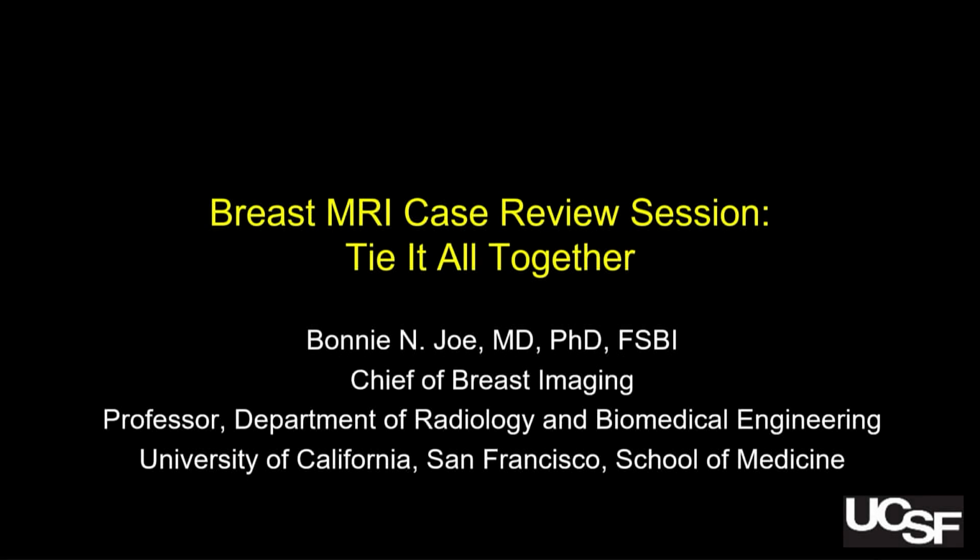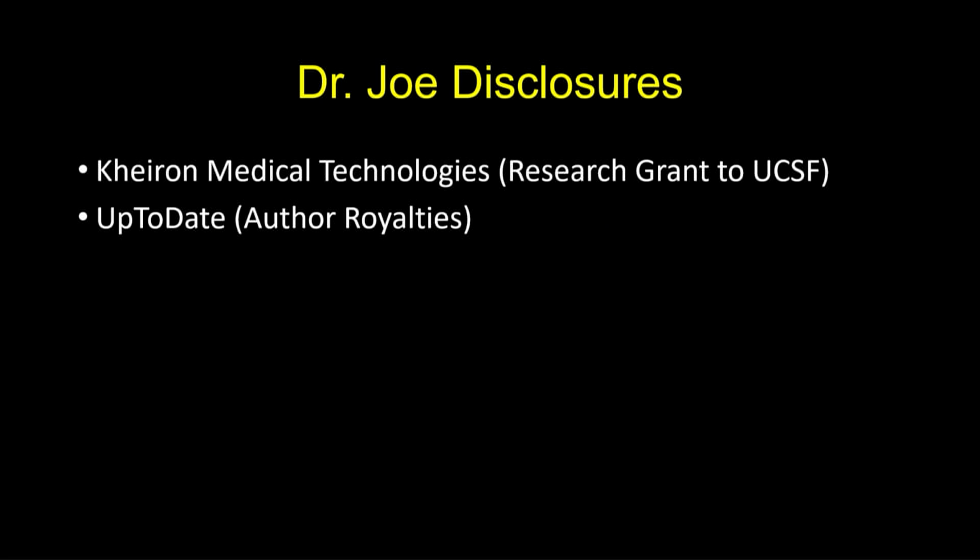Thank you. So this is a case review session. We're shifting gears from subtle mammographic findings. Luckily, MR findings are not subtle, so you can see it from anywhere in the room. The problem is, how do you interpret it? It's not whether or not you can see it, it's whether you want to do anything about it. Sometimes you do miss, there are blind spots even in MRI. So those are my usual disclosures.